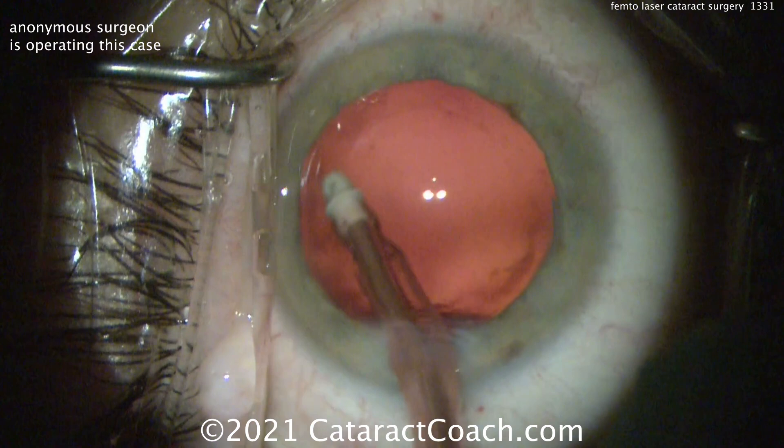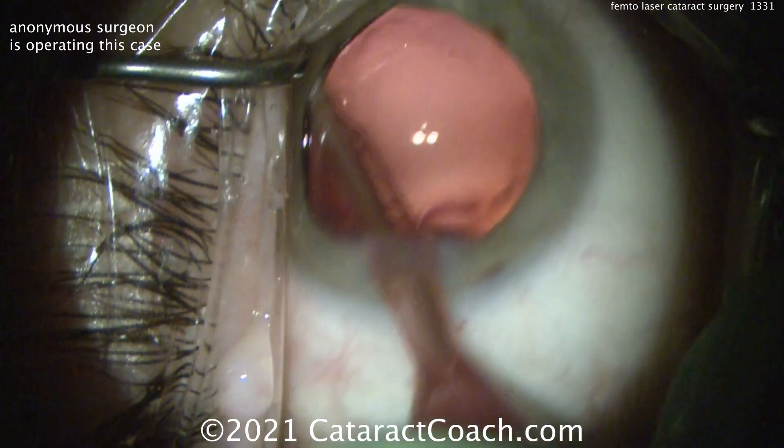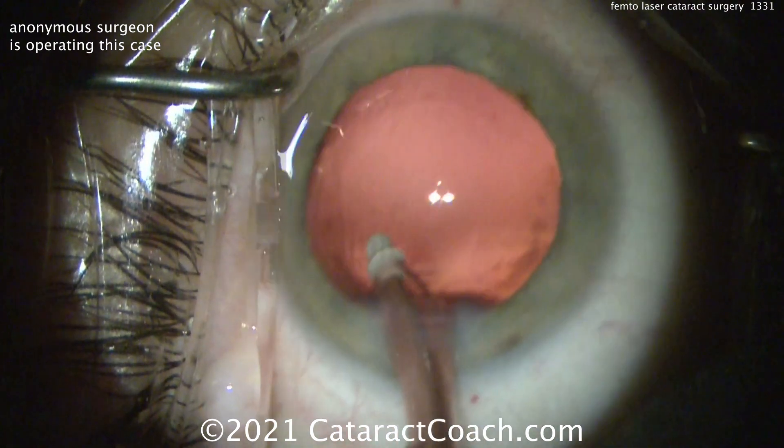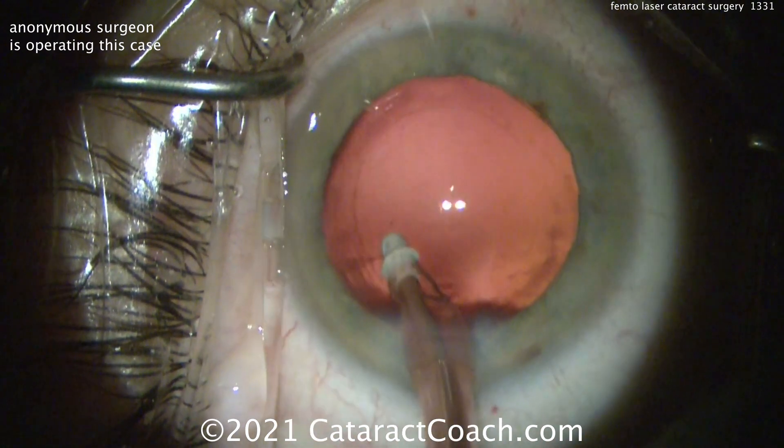So again, polishing up the underside of that anterior capsular rim. Looks like this capsulotomy is probably about 5mm or so — maybe between 5 to 5.5, somewhere in that range. And then the lens will go inside.